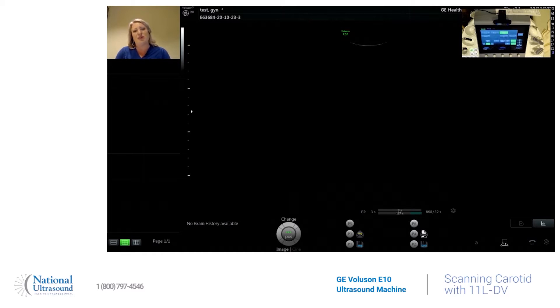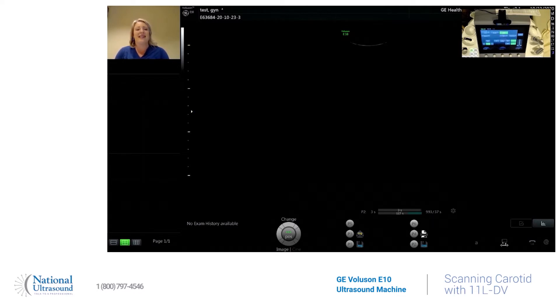I'm going to show you how to determine the difference between the ICA and the ECA in a carotid ultrasound.